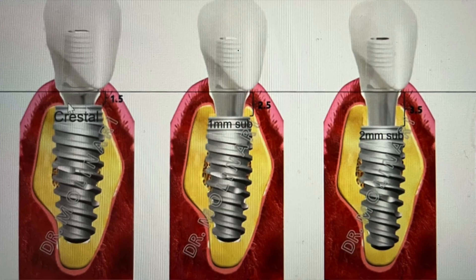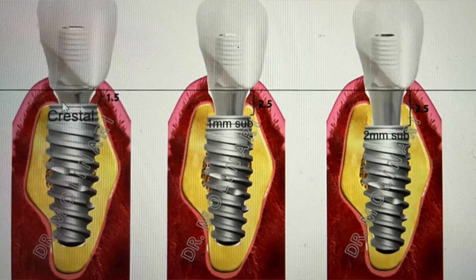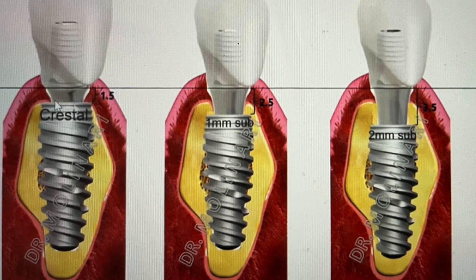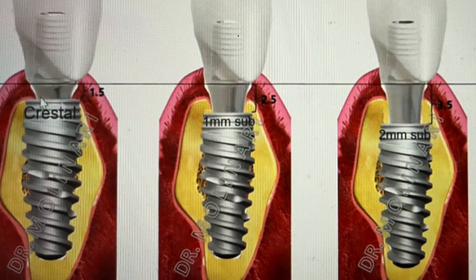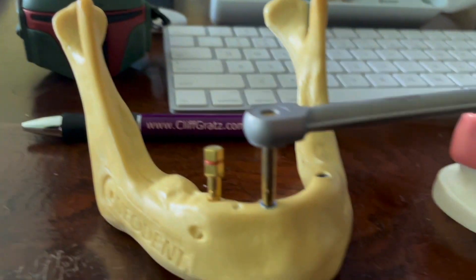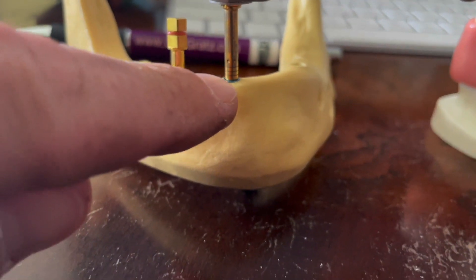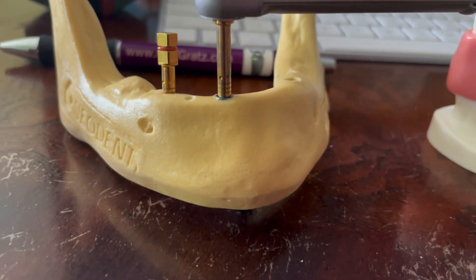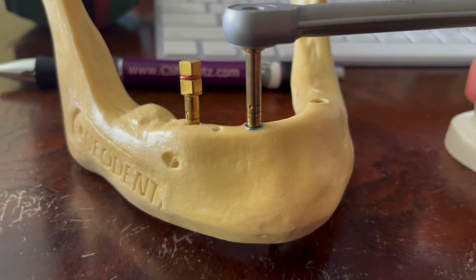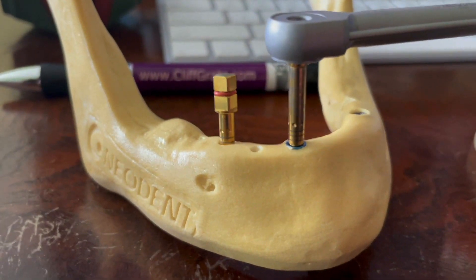We're talking about crestal level placement of an implant versus sub-crestal. Let's take a peek — we're going to spin around. Crestal level versus sub. Looking down on this model here, we can see that our first implant is placed crestal level. We can see those lines that we just reviewed with Dr. Alex Molinari.